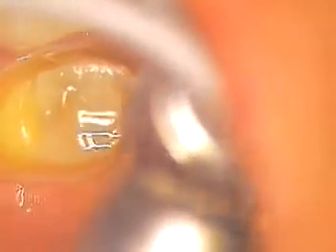And that's it. And now I'll do the distal. Open again. So we'll finish now the distal and that mesial buckle a little bit more there, and we're done. Notice I'm going in a counterclockwise rotation when I'm prepping. This way, because your handpiece is rotating clockwise, it's a rotational thing. And you really get smooth margins by doing that.